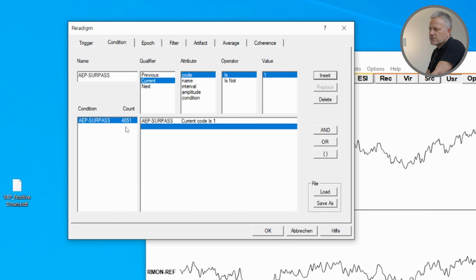There were 4,051 triggers. So that's a lot of triggers. We've done pretty well. We could have done it a little bit longer. That's okay. We go to epoch.